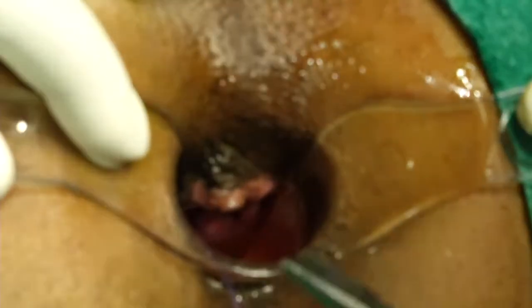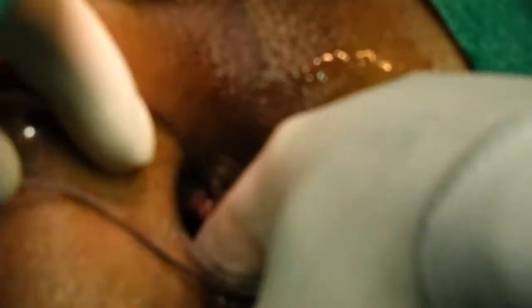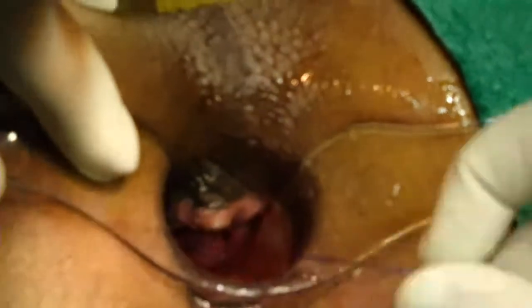So HAL is a very wonderful procedure, using only this suture material, and maximum piles, even grade 4, will shrink.